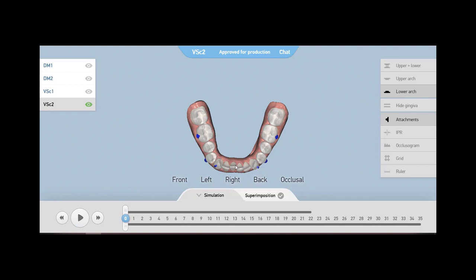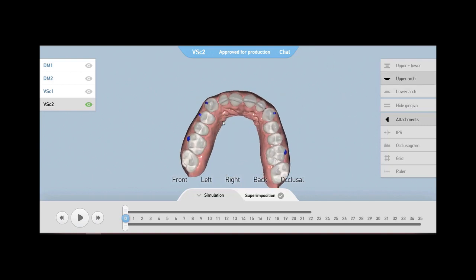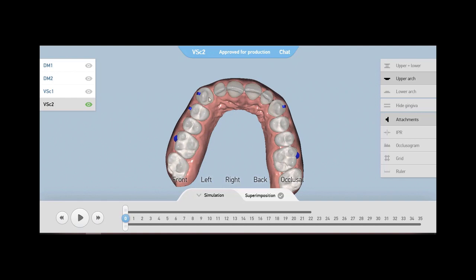In this case of retrusion, we know that we may resolve the crowding by giving the teeth good inclination. When we incline the teeth, they follow a wider arch and we obtain space we need. Also, on the upper arch, we can see the spacing in here that can be beneficial for us.